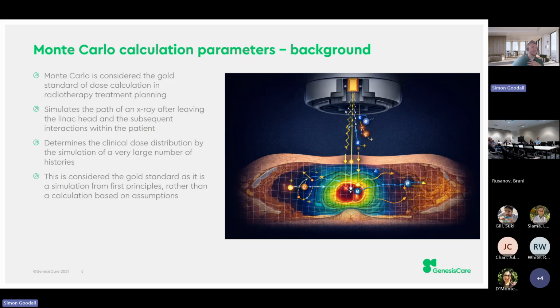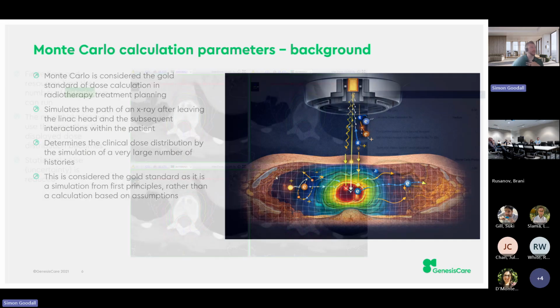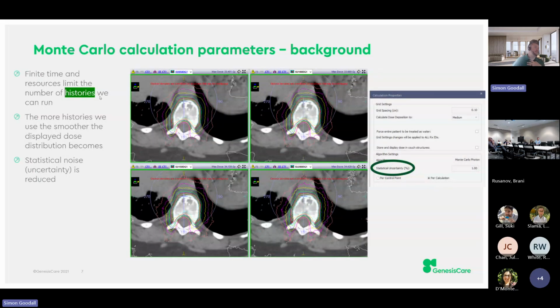Instead of completing a calculation resulting in a dose, we end up with an actual simulation, which means that every time we run one of these particles through, we get one track or one history, and then we have to keep doing more and more to simulate what would be done in a real-world situation. Then we determine the dose at different locations within the body. We like this from a physics perspective because it's simulated from first principles rather than calculated with underlying assumptions or approximations. Theoretically, in reality, these have some assumptions made, but fundamentally they're there.